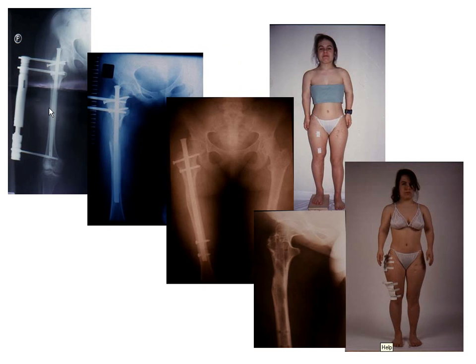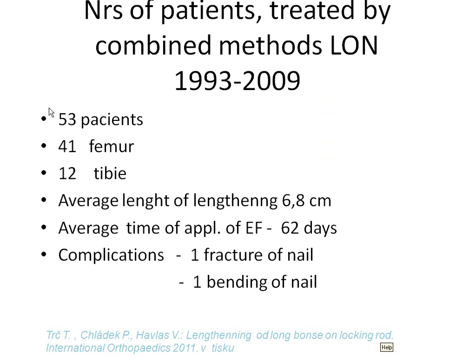In another case, with a chondrodysplasia patient, there was lengthening of 8 centimeters. Here you can see one side is already lengthened, and the second side is starting. The same procedure: application of the rod, external fixation and osteotomy, distraction, and when we have made the distraction we lock it. You can see that the development still continues, and the patient after that is quite satisfied.